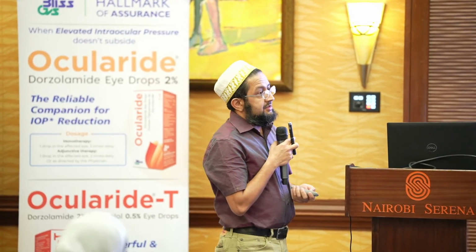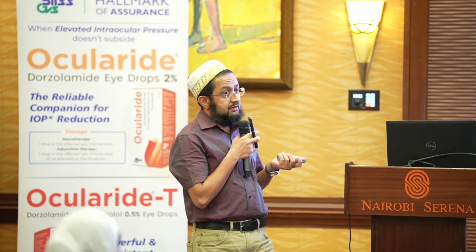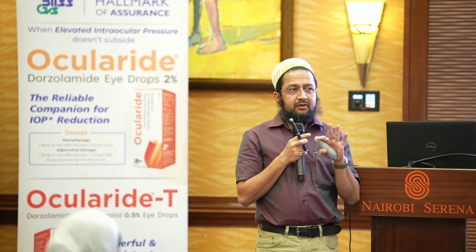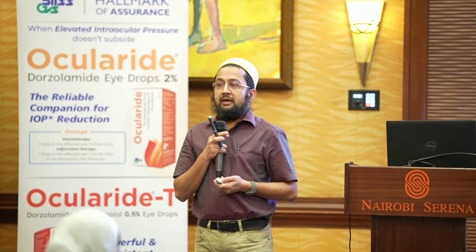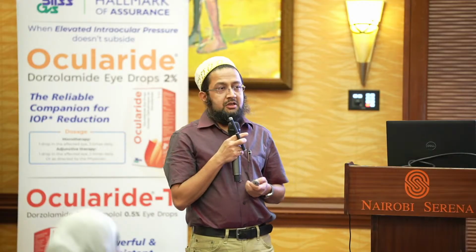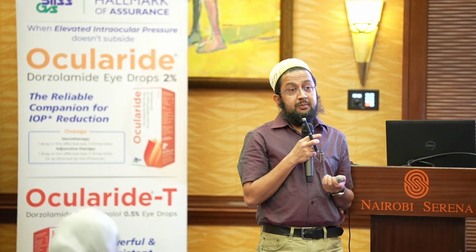Now we come to the vitreous. You'll be looking for cells, flare, snowball opacities, snow banking, and vitreal strands. Now, something I want to make a bit clear to everybody. When it comes to snowball opacities, snow banking, preferred mode of examination, use your indirect. I think the VR surgeons are going to agree with me. If you're using your slit lamp, you're not going to reach there. And most of the times, these patients do present with pars plana membranes, so you'll have to actually depress the eye to look very carefully at the ora.